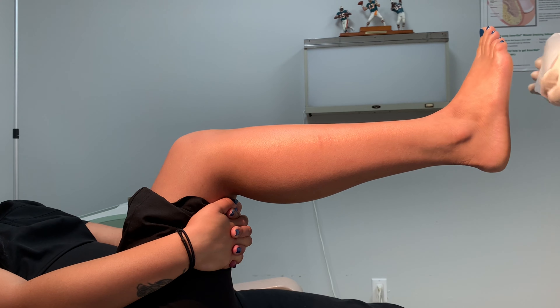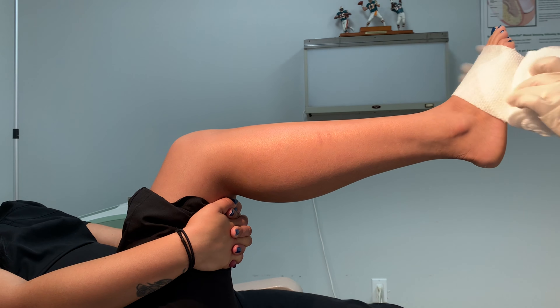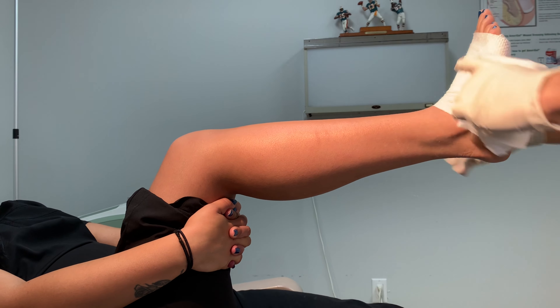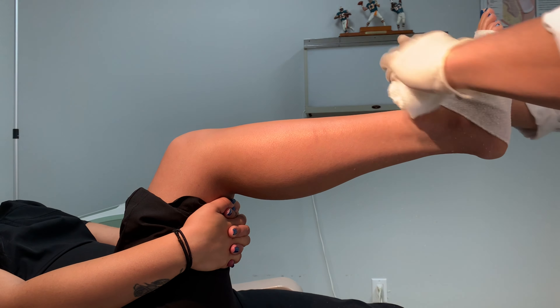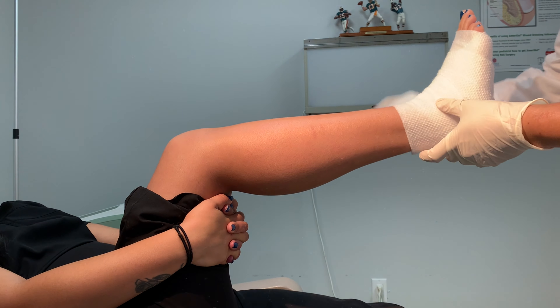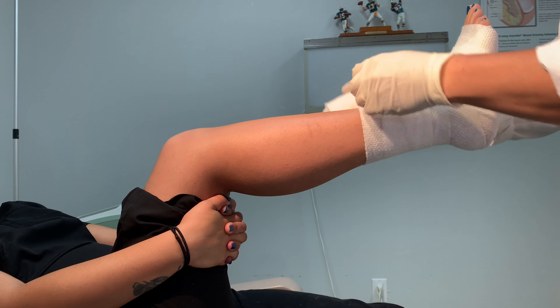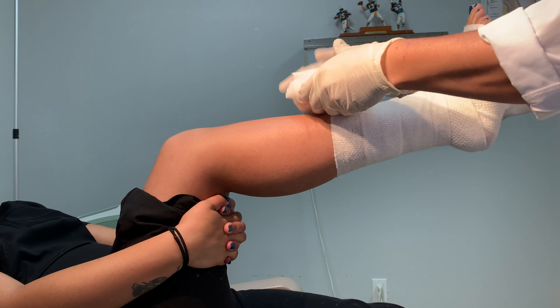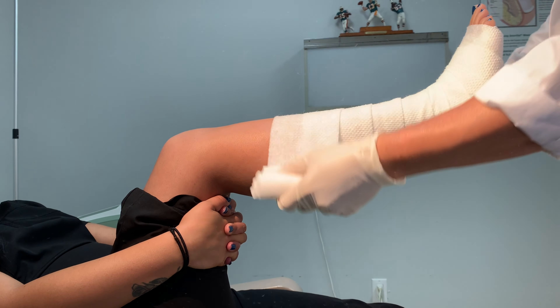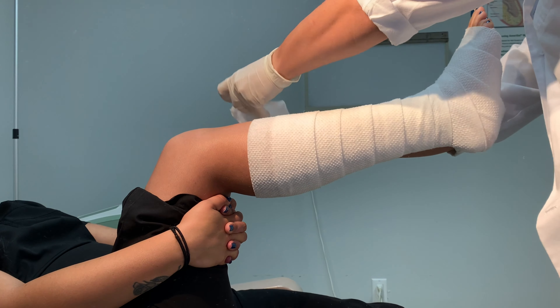While applying the splint, try to keep the ankle at around 90 degrees with the foot in a neutral position. This holds true for most cases; however, consider each unique situation. Start with one roll of cast padding and apply a 1-2 layer thick wrapping from the forefoot up past the injury. It is not vital that you get this layer up to the knee.